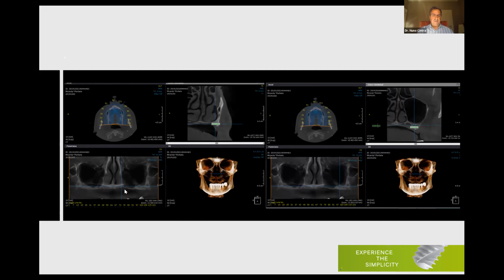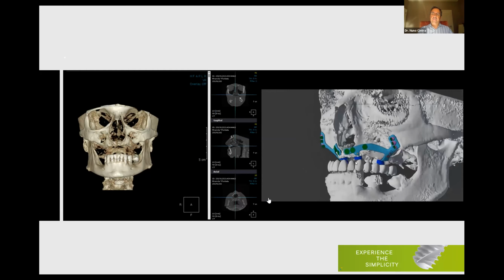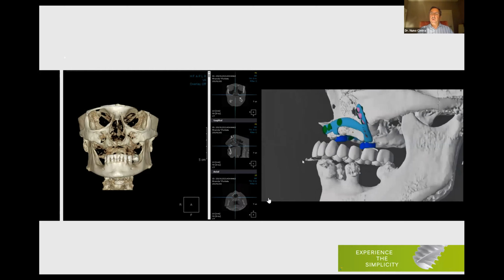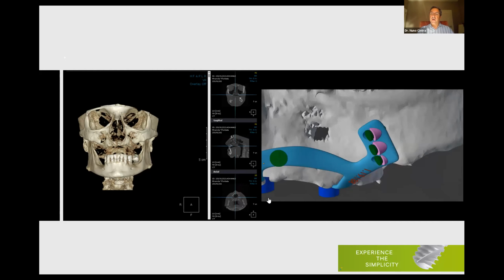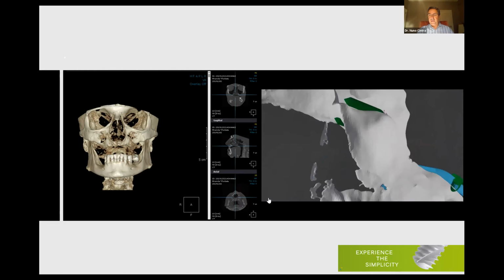And on the left side, again, 6 millimeters there and 7 millimeters at the back. So instead of short implants, we decided to use a custom implant. Of course, we could go for short implants, and if you have experience with short implants, go for short implants. But we can also think about a custom implant. A custom implant can be something like this. It's an all-on-4 with a custom implant which is made for the patient.